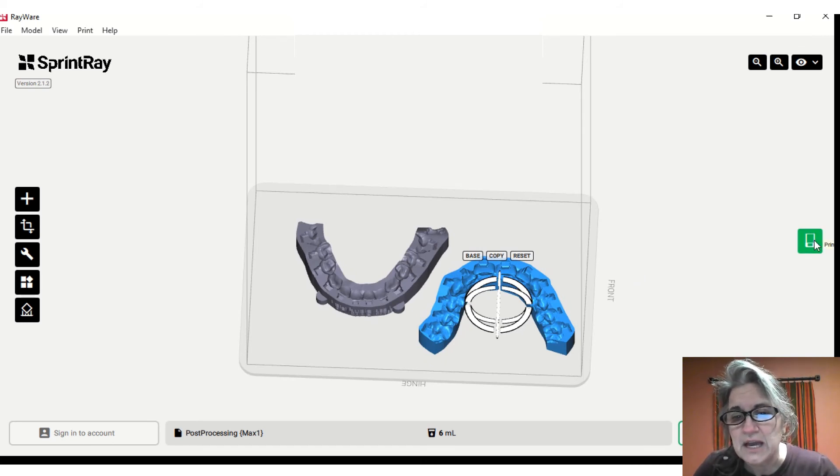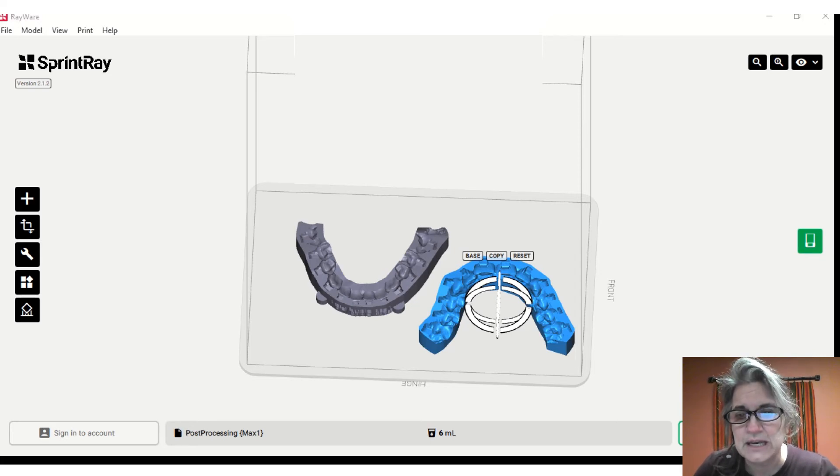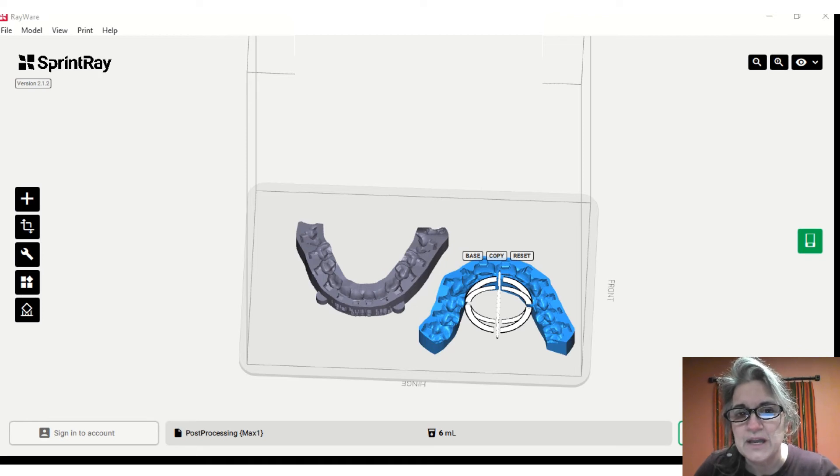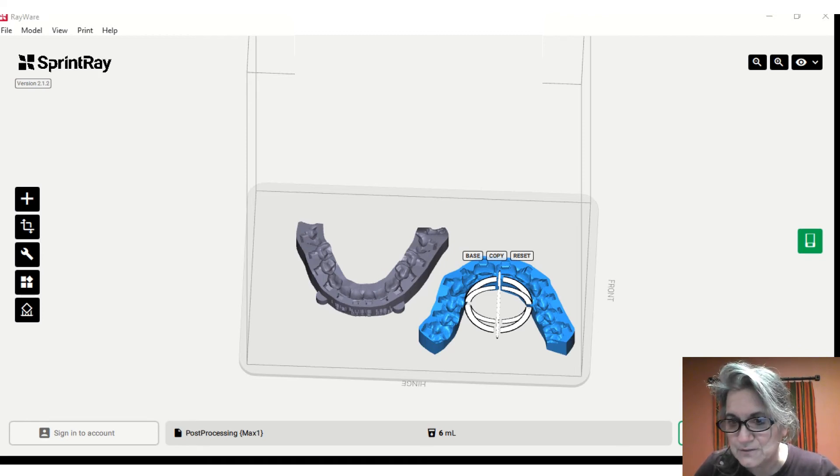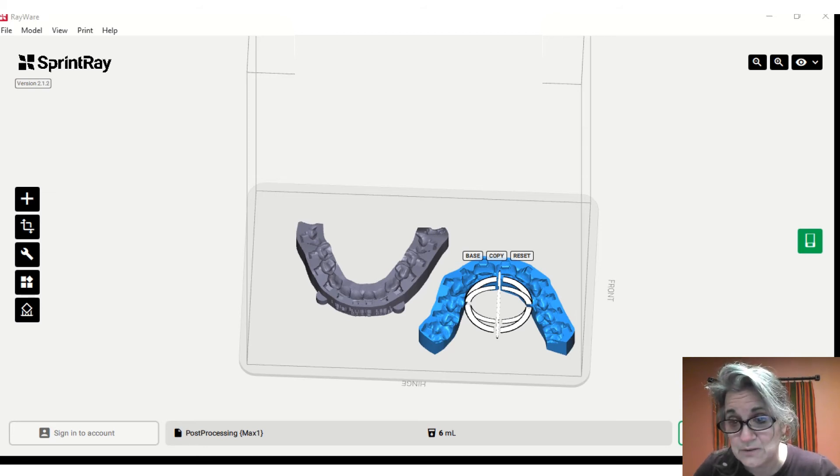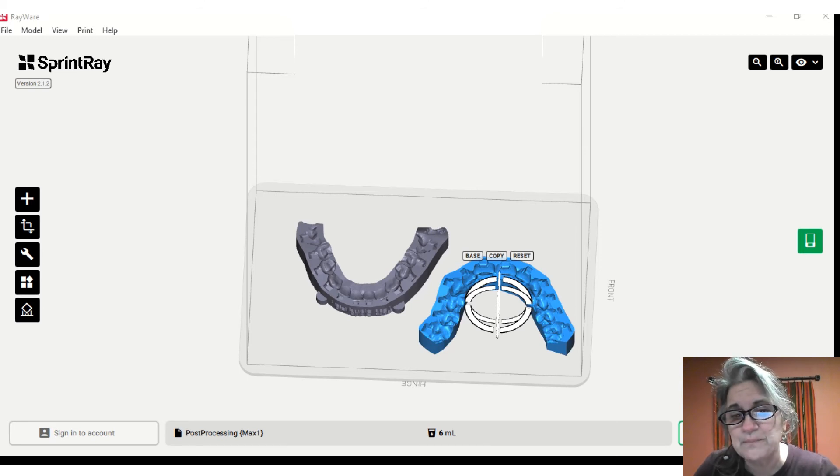Now remember when you print, you can print at 100 microns. I like to print at 50 microns because it gives me a little bit of a clearer tray. You're going to want to make sure that you select that 50 microns. Also select your material. We currently use the NextDent resin, but there's also a SprintRay IBT resin available as well.